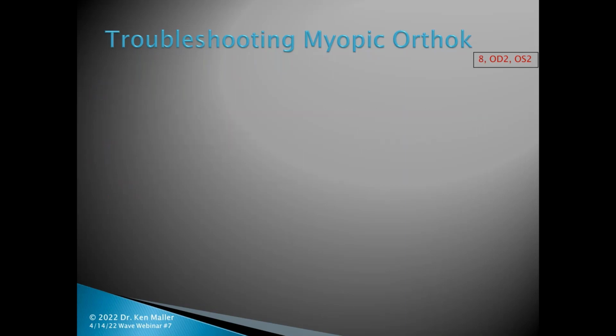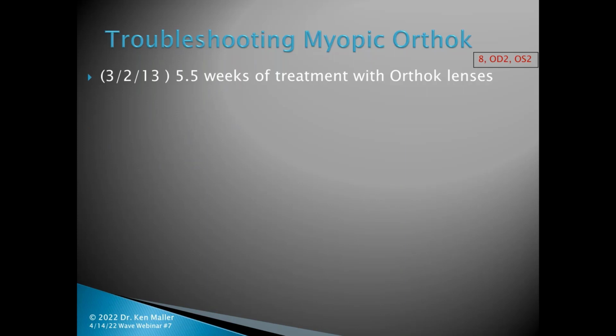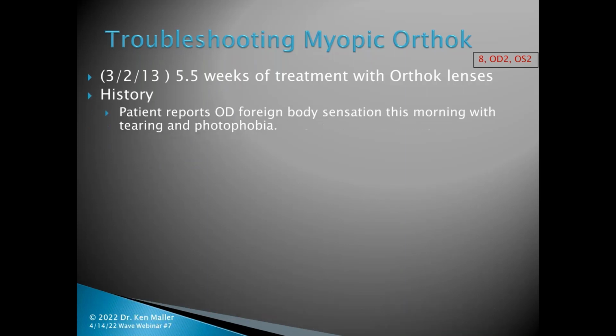So at the 8th visit, wearing OD number 2 and OS number 2, he's 5.5 weeks into Ortho-K. Patient reports OD foreign body sensation this morning with tearing and photophobia.